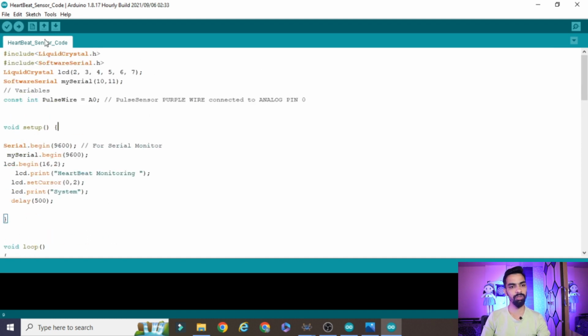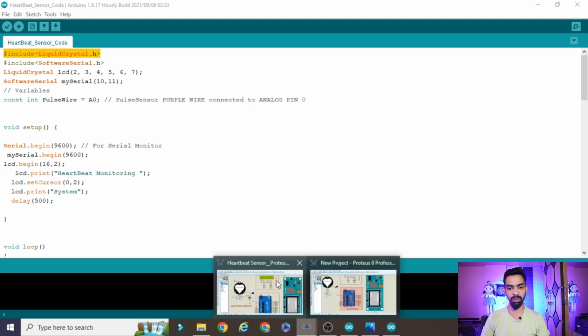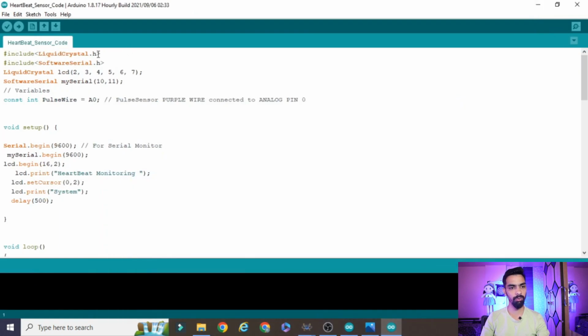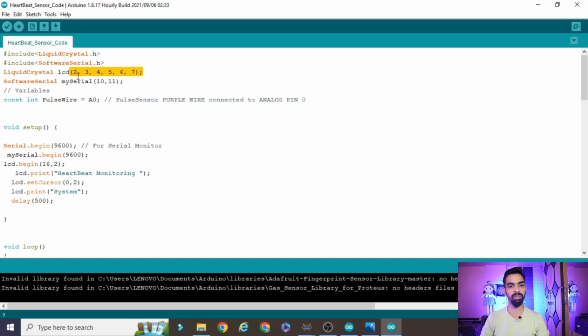Now we will see the importance of each and every line of the code. The first line is #include LiquidCrystal.h. Whenever you require the LCD, and we have used the LCD in our project, you require this library. Then SoftwareSerial is basically used to connect the GSM module to the Arduino. Then for LiquidCrystal, we already saw that the LCD pins RS, Enable, D4, D5, D6 and D7 are connected with the Arduino pins.